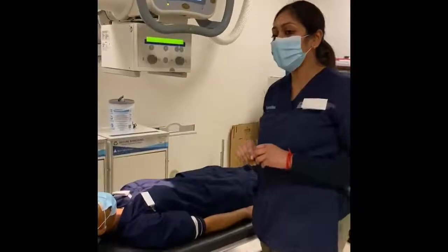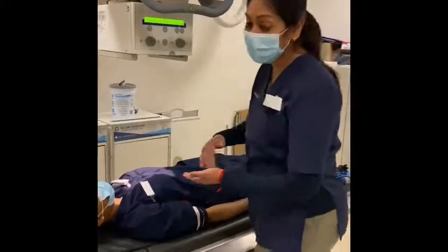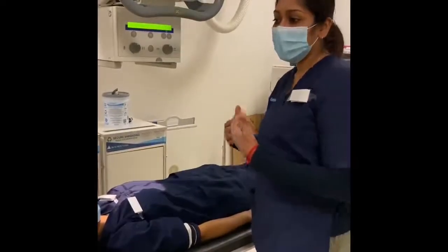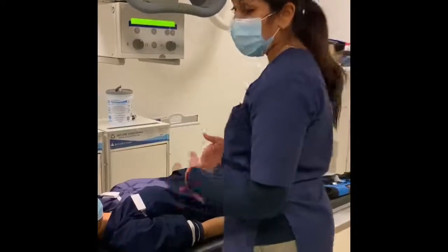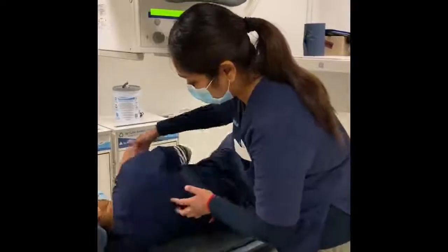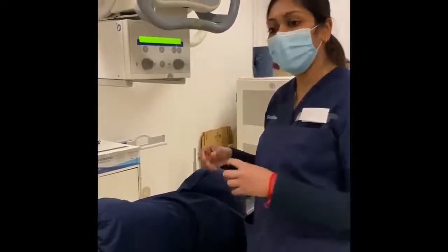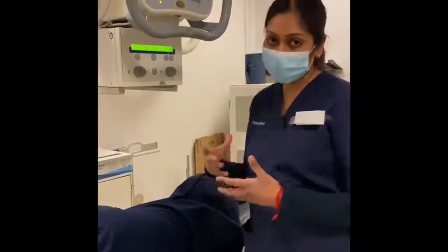Okay, so for the lateral supine view of the T-spine, we need to turn our patient on the left side or on the right side. Ideally, it's good to turn your patient on the side such that you are on the posterior side of the patient. Example, we're going to turn this patient to face that wall. So standing behind the patient just gives you more support, and it allows you to position better.